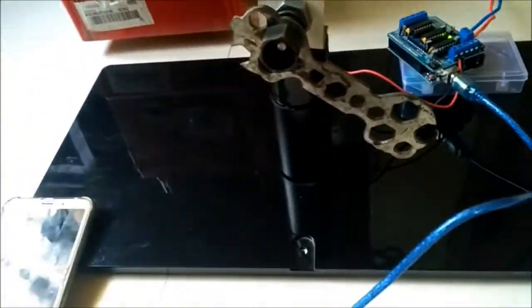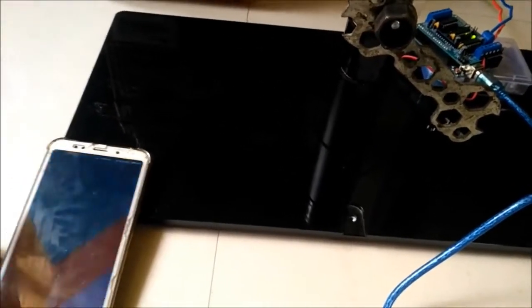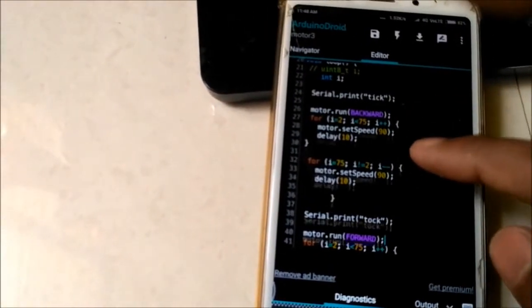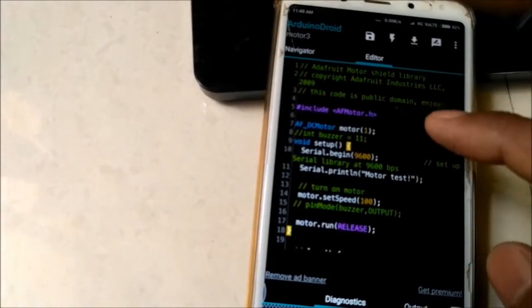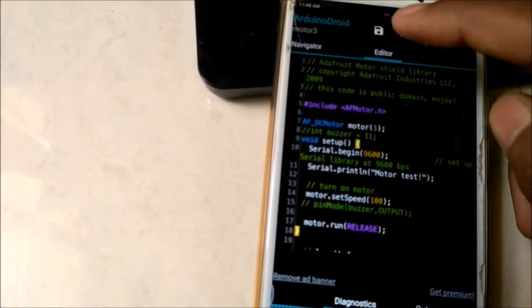So the programming is done via this USB cable, which is connected to a system. Here we are going to see how we use this via an Android phone. You can see the code required to run this DC motor is written here. This is an editor which is available, either we can do it through a PC or through an Android phone. It has a compiler editor, so we have to compile this program.